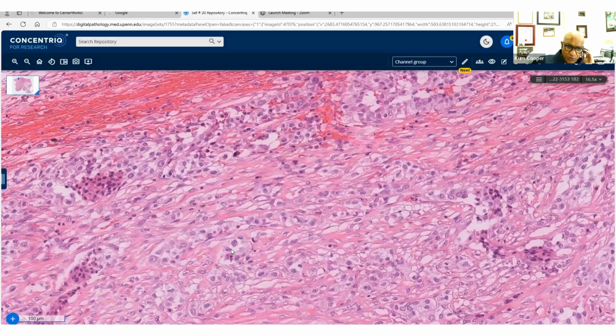So to come back to your clear cell sarcoma, as well as the previous speaker who suggested GNET, we would then resort to molecular confirmation. In this instance, we used FISH to probe for EWSR1, and that was rearranged. So you're spot on. Yes, GNET, and we do use malignant gastrointestinal neuroectodermal tumor for the clear cell counterpart in the bowel wall.